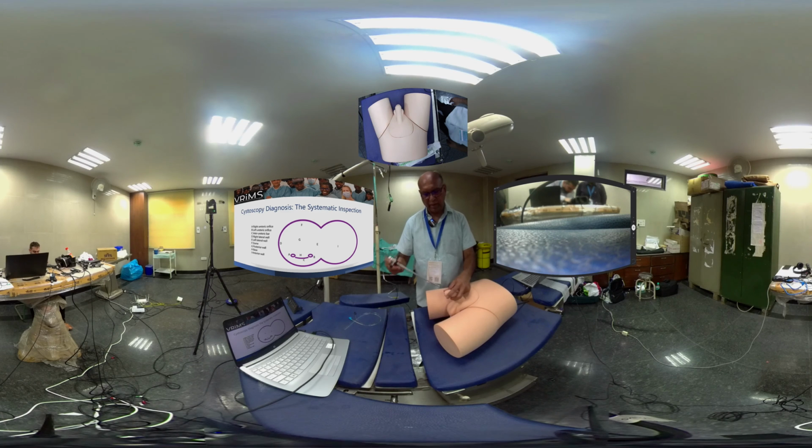And then while doing the scopy, sometimes the telescope or the camera here sticks out, and it can cause injury, and this is the most smooth part. So, you need to lubricate well and pass like this, and then straighten it to 12 o'clock position. Okay. Then you can see the picture in the monitor, and you should gently pass the scope under vision. So, if you see like this, you should not push. If you see like this, you should not push, because that can cause injury. So, here gently pass, and then this may be the sphincter level where you have to turn up and then go into the bladder like this.